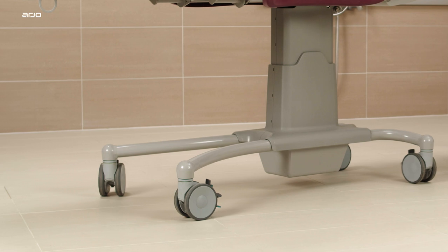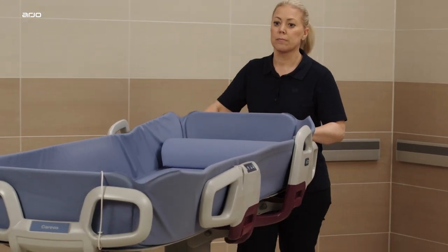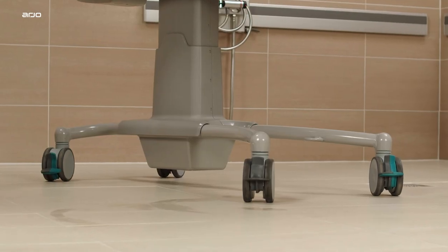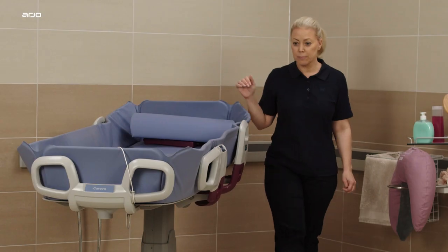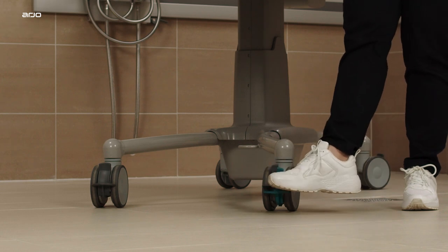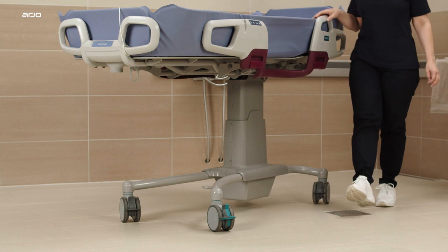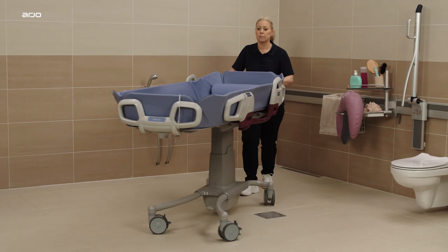For easier manoeuvring when transporting the Corivo in corridors or around corners, use the straight steering device. The straight steering devices are green and located on two casters diagonally from each other. Apply the straight steering by pressing down on the green straight steering lever — specifically the lever that is furthest away from where the caregiver is standing. Do not apply both.